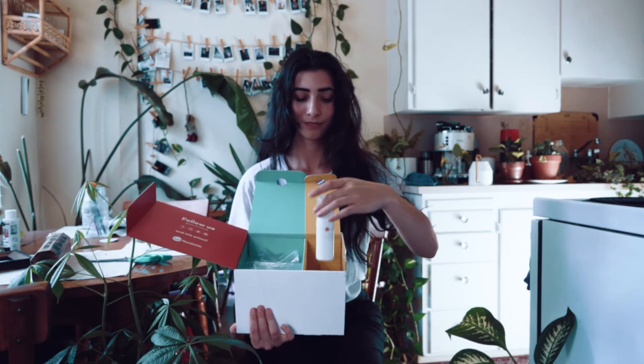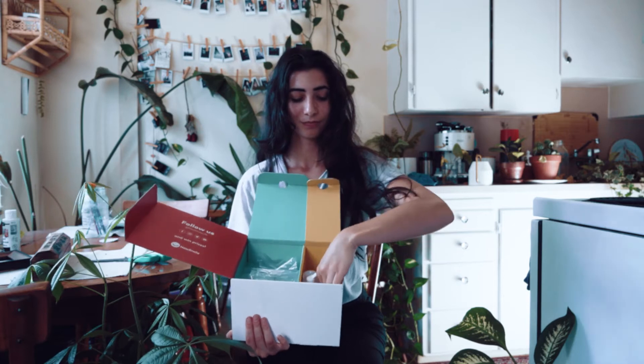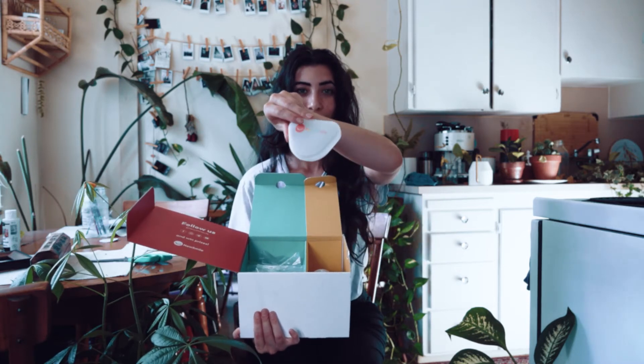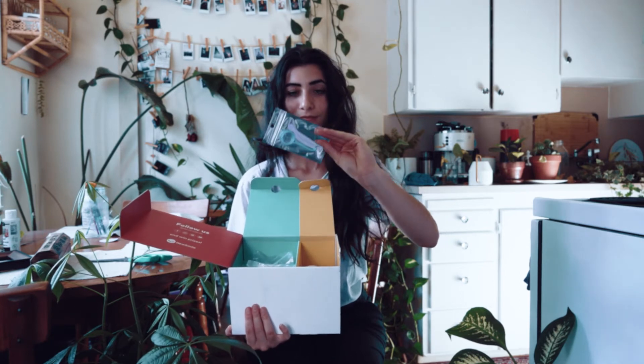In the accessories you get a foaming whitener as well as a container to hold your aligners and some cleaning supplies.